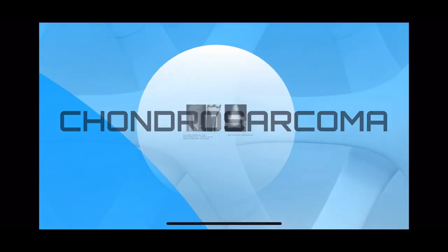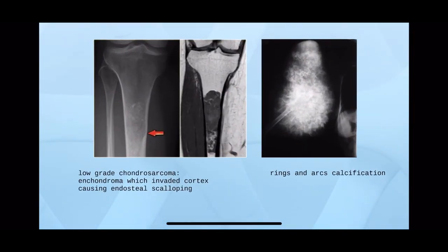Chondrosarcoma can be primary or secondary — secondary arising from osteochondromas or enchondromas. The first picture is chondrosarcoma arising from enchondroma. Enchondroma in the medulla shows popcorn calcifications, but if you see the cortex has been invaded — endosteal scalloping of the cortex — this denotes that chondrosarcoma has replaced the enchondroma.